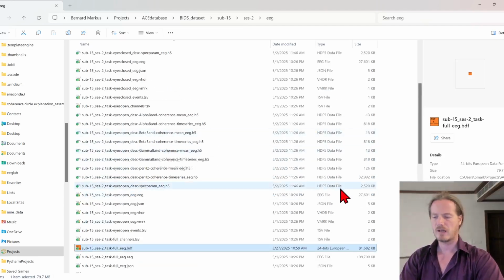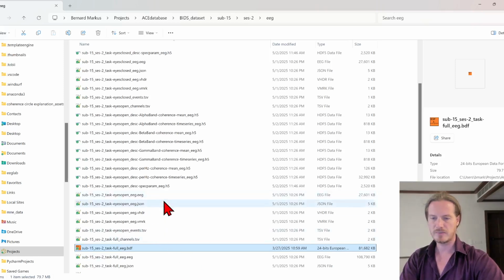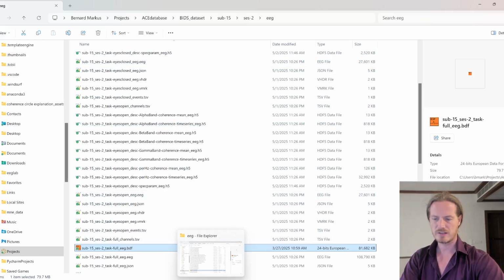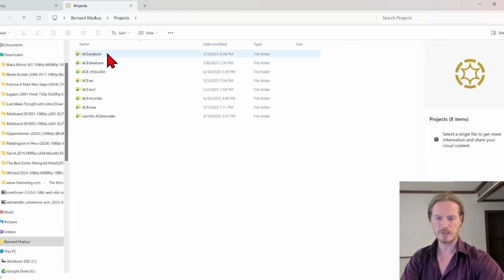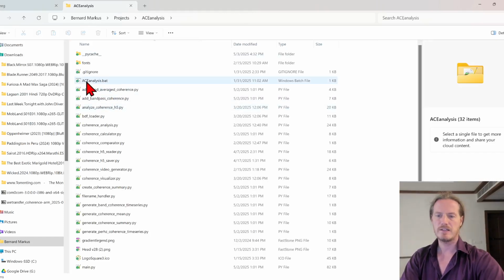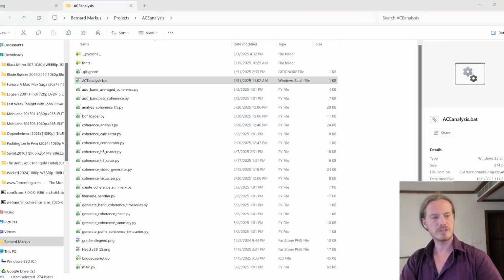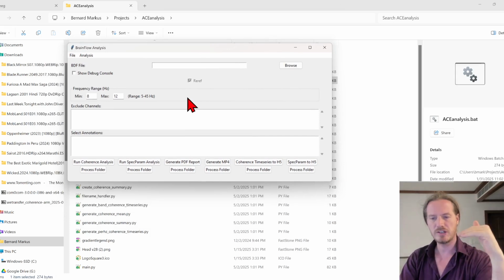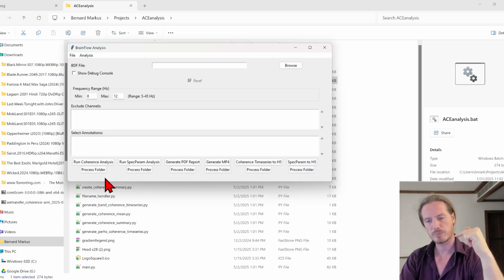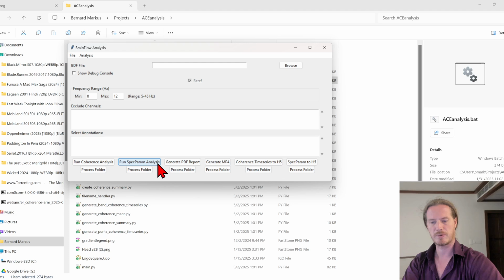And then after it's there and in a structured database by subject and by session and all of that, it sits in the database, and all these additional files are not there yet. For that, we go into another program called ACE Analysis. And ACE Analysis goes into the database. So here we have ACE Analysis, and it reads the database and it sees any new files, and then it processes the newly found files in the database, and it can run the coherence analysis or the SpecParam analysis, which is a different measure, very important actually for our purpose.